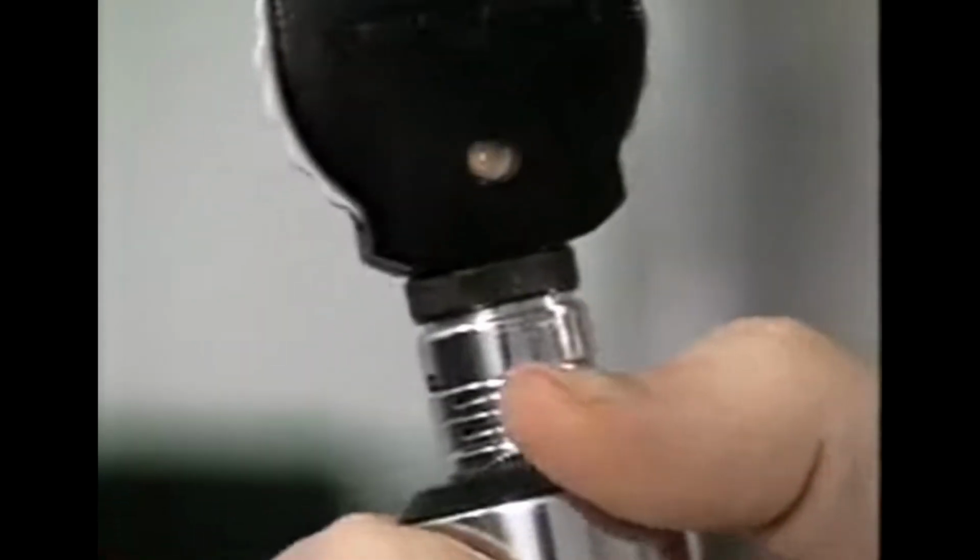Get to know your ophthalmoscope and its parts. This button turns it on and adjusts the light intensity. This dial adjusts your focus. Hold your ophthalmoscope like this so that you can adjust the focus during the examination.